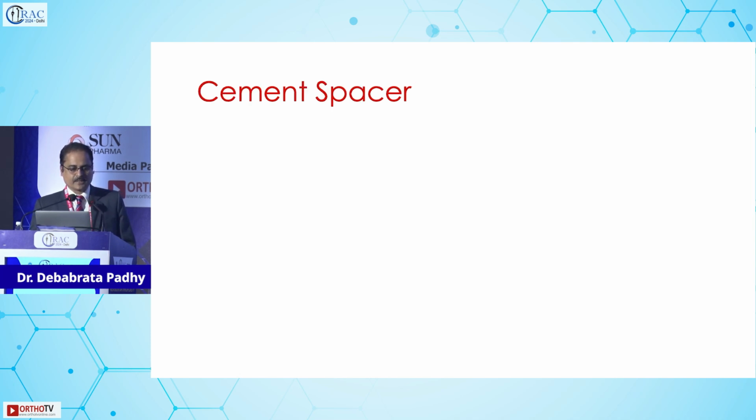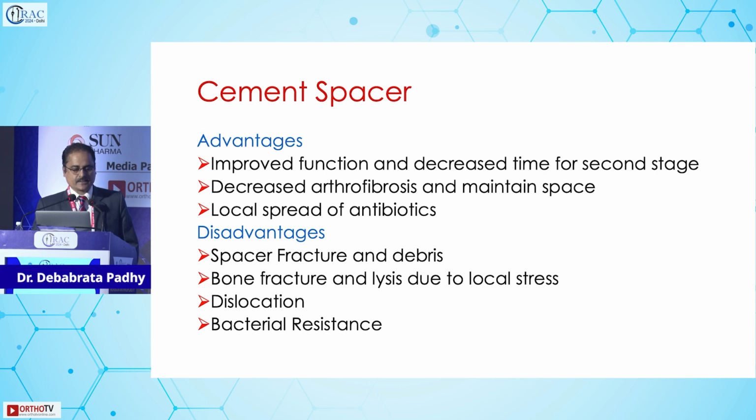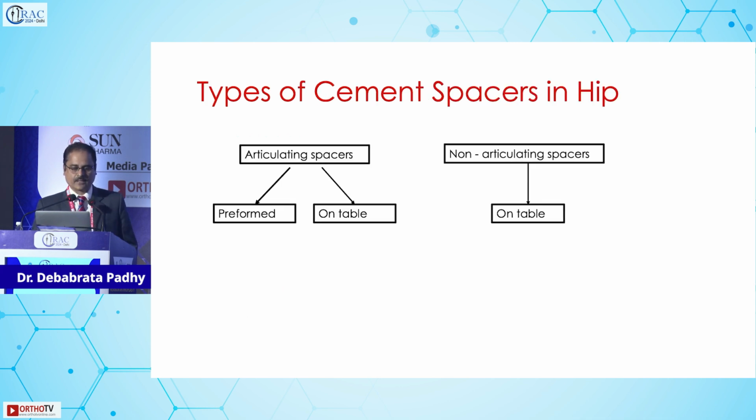When you think of a cement spacer, we should know what the advantages are. It improves function, decreases the time of the second stage, decreases arthrofibrosis, and maintains space and local spread of antibiotics, which is helpful for decreasing the infection. The disadvantages, of course, are there. The spacer fracture may occur. There may be debris, which may be a source of infection later. Bone fracture and lysis due to local stress, dislocation, and bacterial resistance can occur if the antibiotics are not correct.